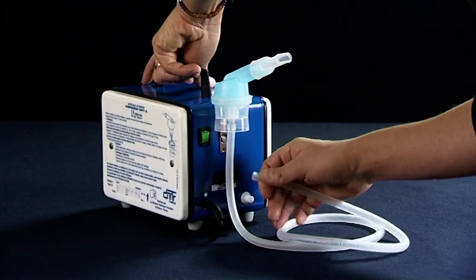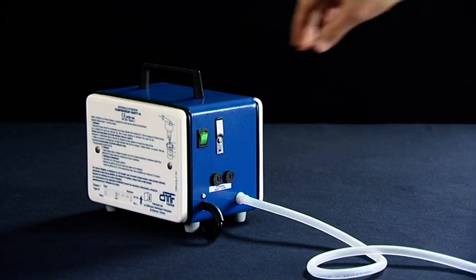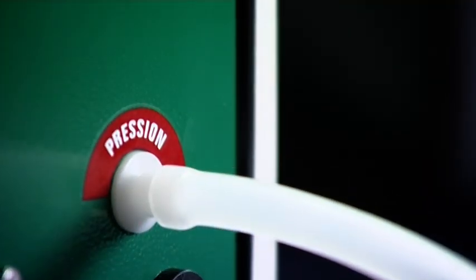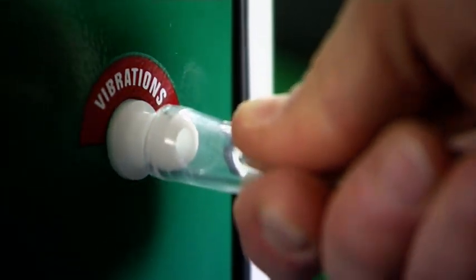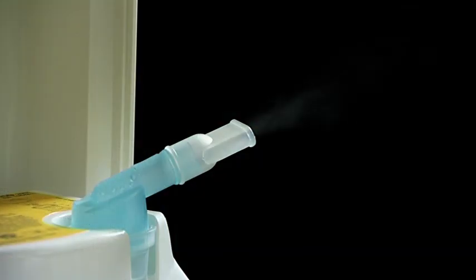Both assembling and operating procedures remain the same whether the compressor has a metal frame, like the model ATOMISOR Vanity, or a plastic frame like ATOMISOR Box, as well as for the ATOMISOR Sonic Vanity and its equivalent Sonic Box Plastic. For all the models, at the end of the session, the nebulization becomes irregular, discontinuous, and then stops.